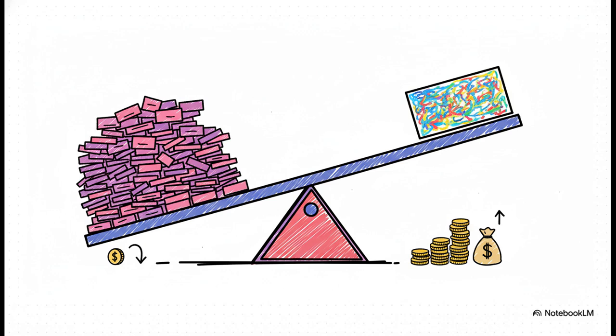Right, so we have these two main tools. The H&E slide is the workhorse. It's cheap, it's everywhere. It's kind of like a black and white photo. The mIF slide, though, that's the specialist. It's super powerful, like a detailed thermal scan that shows all the hidden activity. But it is extremely expensive and takes a ton of work. And that cost difference creates a massive bottleneck for research. We have millions of the simple photos, but only a tiny fraction of the detailed scans.